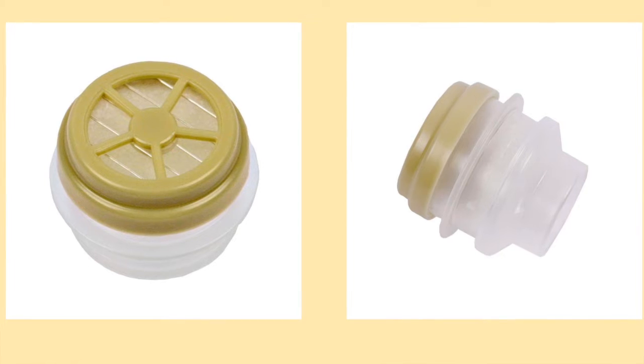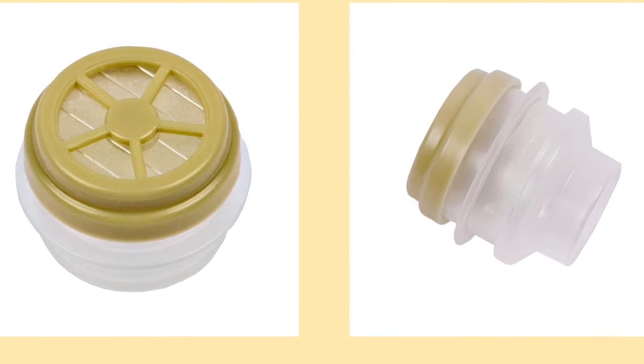For people who do not use a ventilator, there are special HMEs designed to help patients with tracheostomies and laryngectomies speak without requiring finger occlusion. The device consists of a combination of HME and an automatic speaking valve. The valve closes automatically when exhaling air for speaking, enabling the air to be diverted through the vocal cords or voice prosthesis. It reopens automatically when exhalation decreases. Additionally, this HME enables easy removal in case of coughing. Some HMEs also have an adjustable cough relief valve. This helps release the air that is built up during coughing.